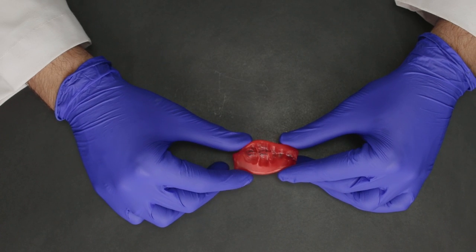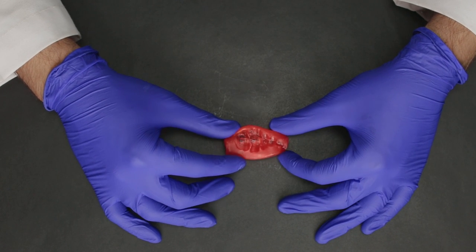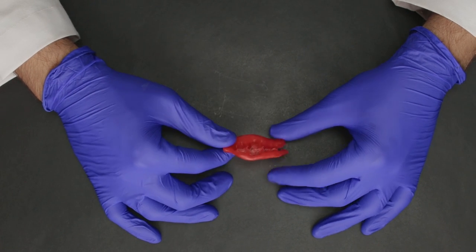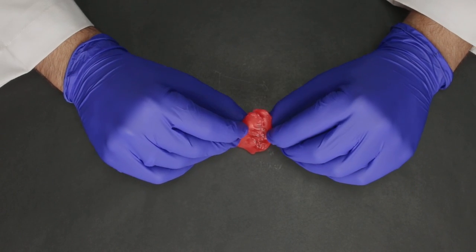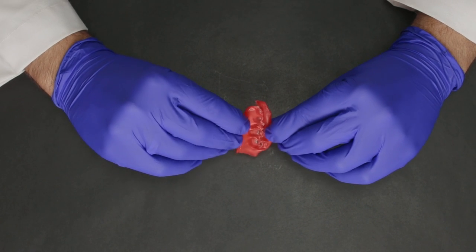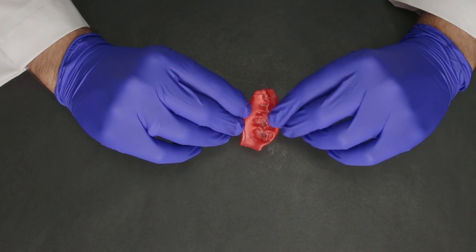The most common material that some dentists use for registering bites is modeling wax, which is the worst of them all. This is what the wax bite looks like — it's just a piece of wax which has been folded over and used for the bite. There are lots of issues we face in the lab with these kinds of bites. They almost always distort when you're removing it from the patient's mouth, and even when transporting it to the lab, there is a lot of distortion happening. Please do not use modeling wax for bite registration as it is really not that accurate.